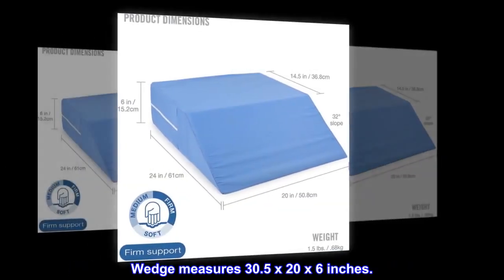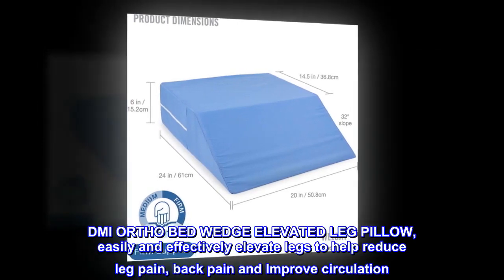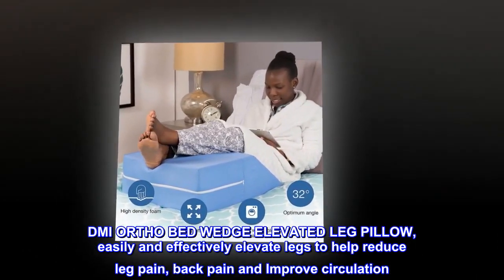The wedge measures 30.5 x 20 x 6 inches. The DMI ortho bed wedge elevated leg pillow easily and effectively elevates legs to help reduce leg pain, back pain, and improve circulation.